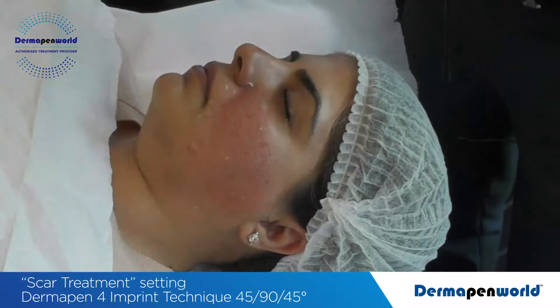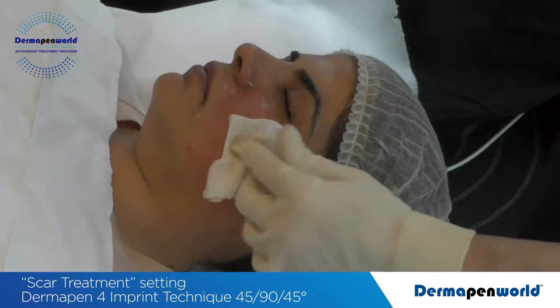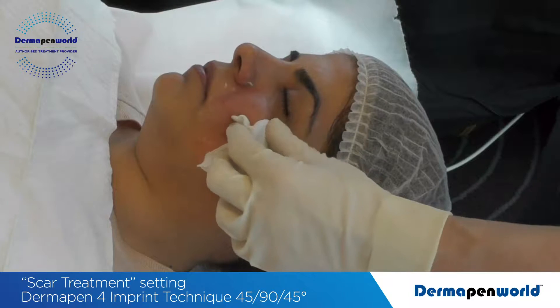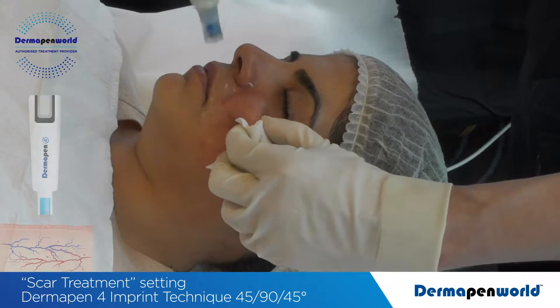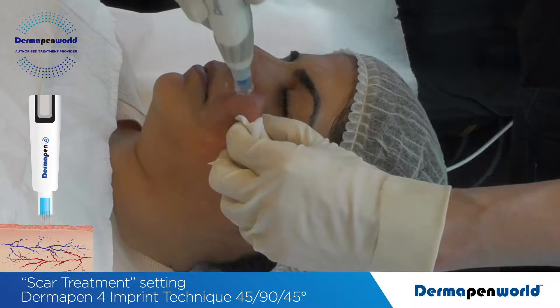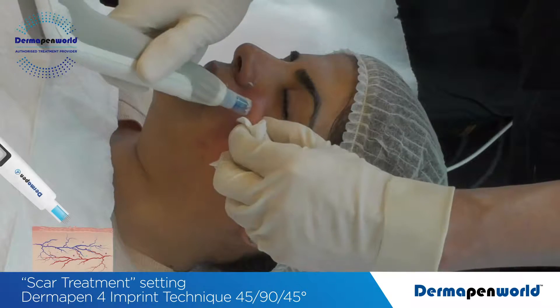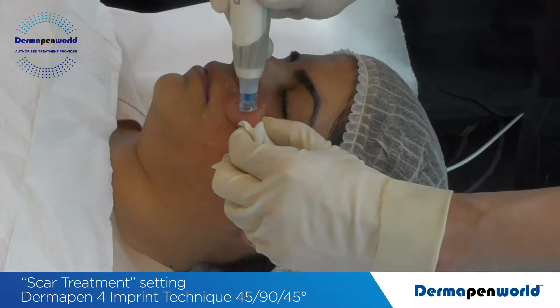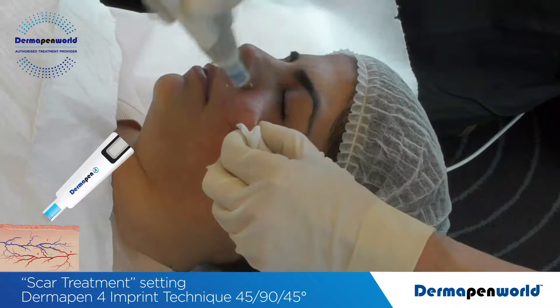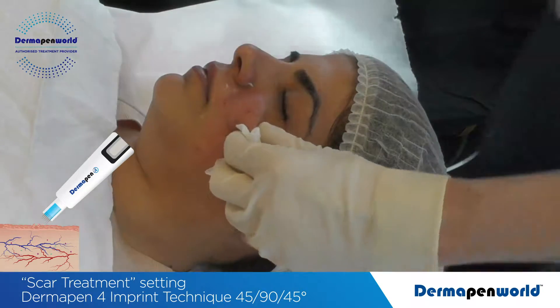Hold the skin in position — the skin is going to be slippery, so use gauze if you need to. Holding the skin into position, you can see that this now becomes three-dimensional. Apply at 90 degrees, then 45 degrees. You'll notice that some of the needle cartridge has raised, meaning not all 16 needles are going in, but you will have 50% of those needles.